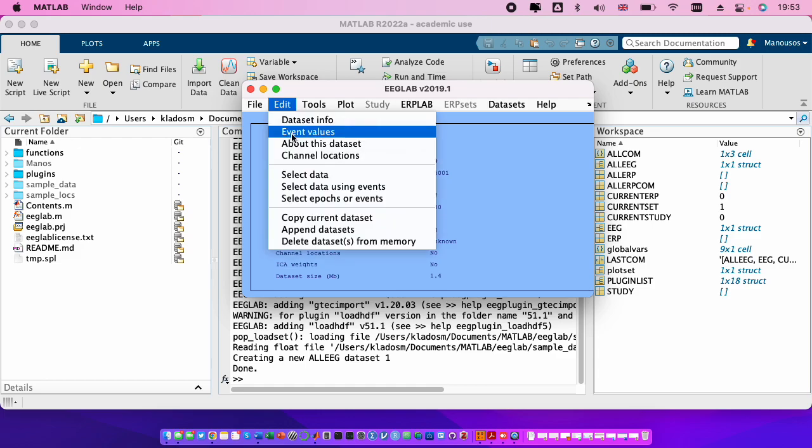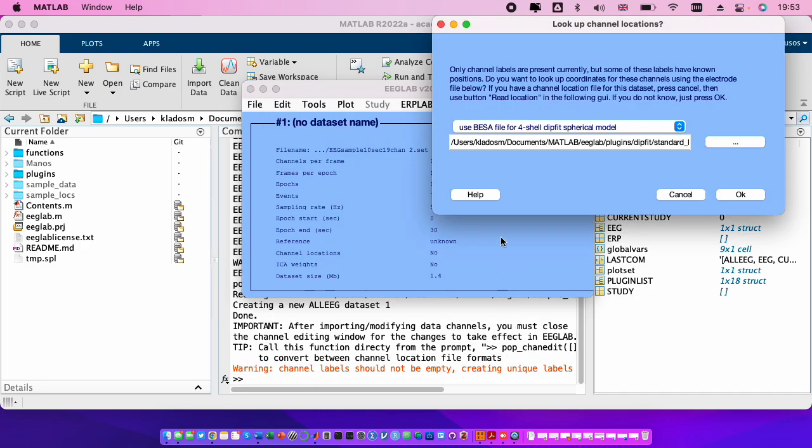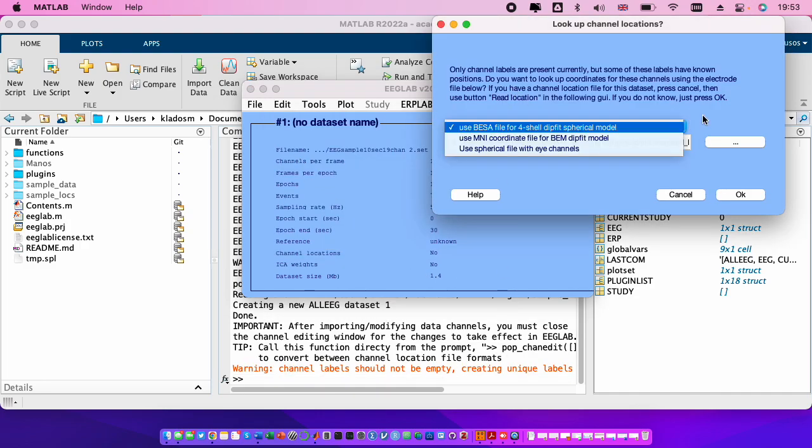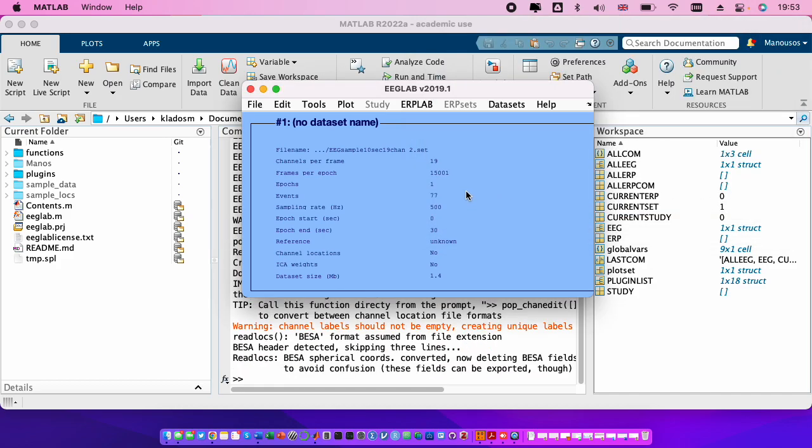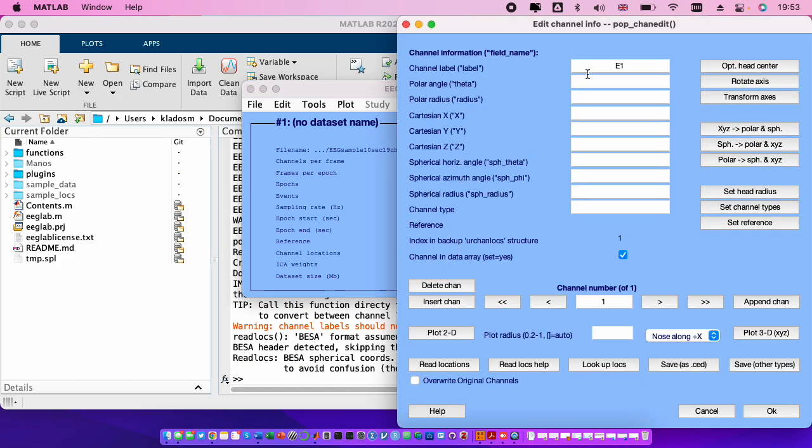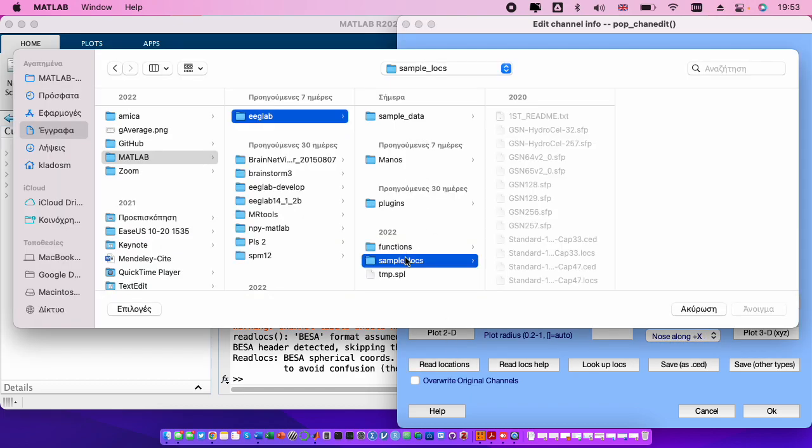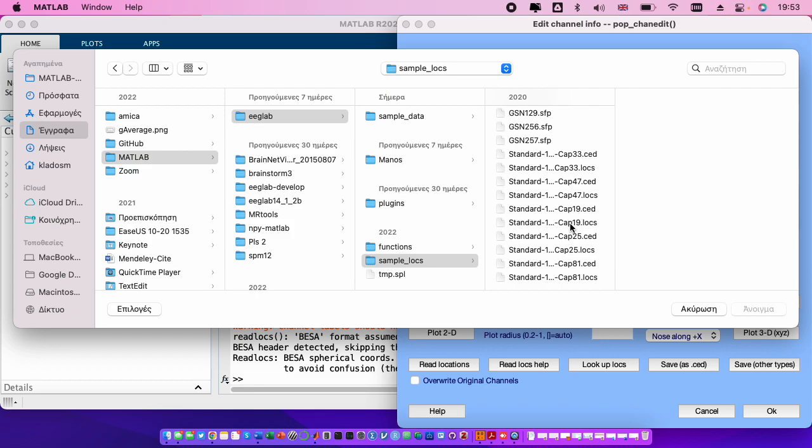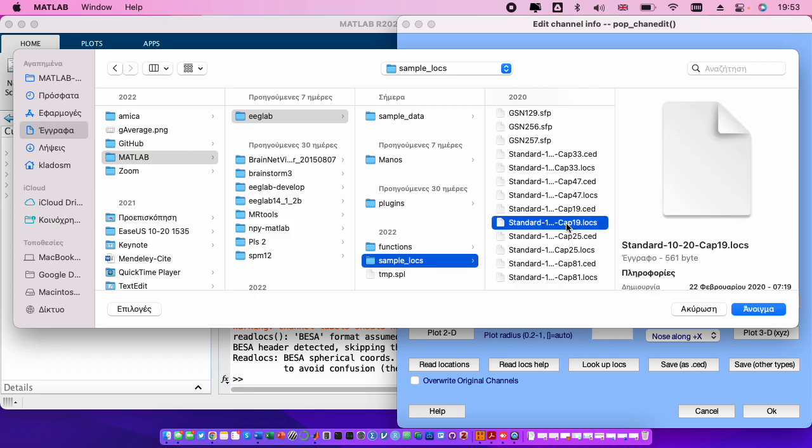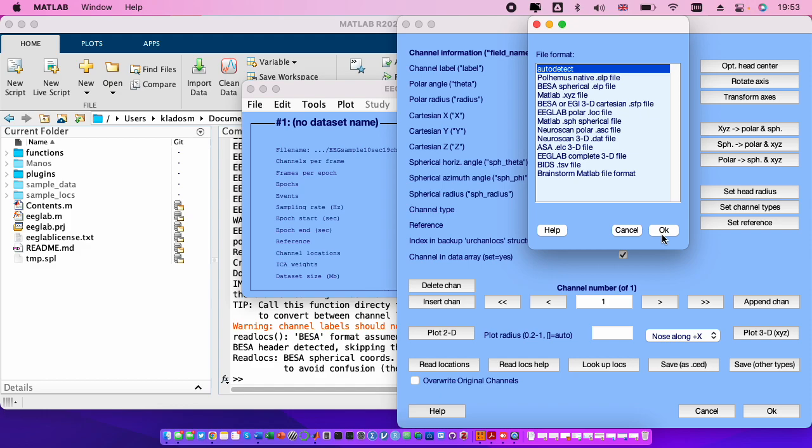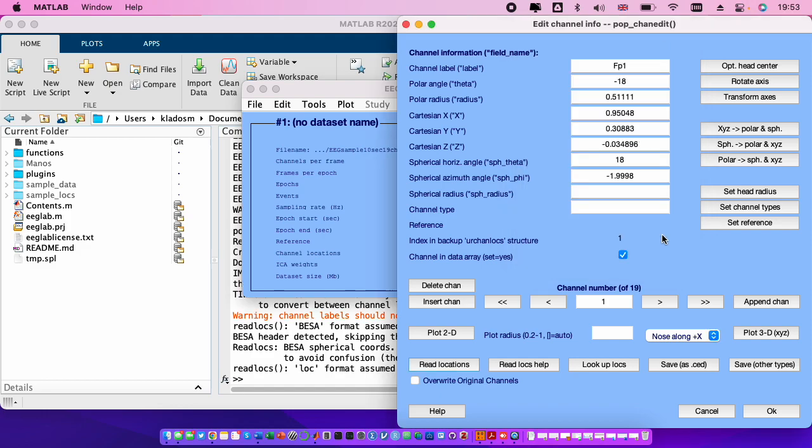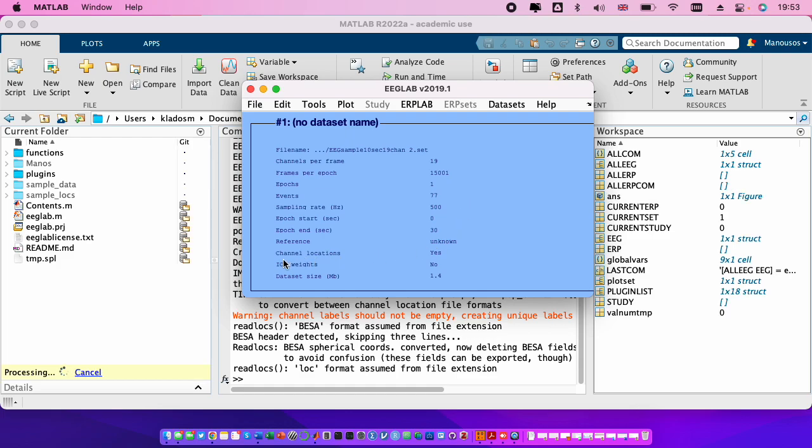So we go to edit channel locations here, we press ok, and then we go to read locations. We find the locs file or the ced file, the cap 19, let's say open, auto detect, and voila, it's ready.